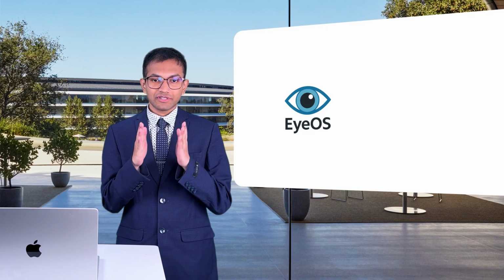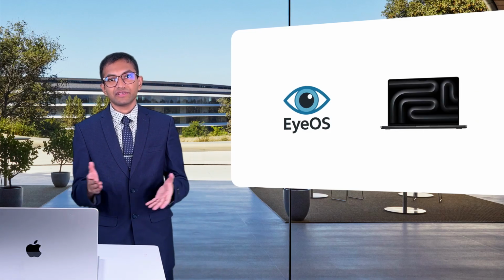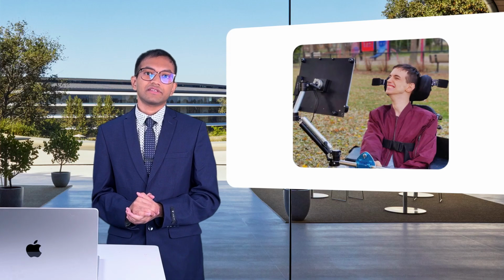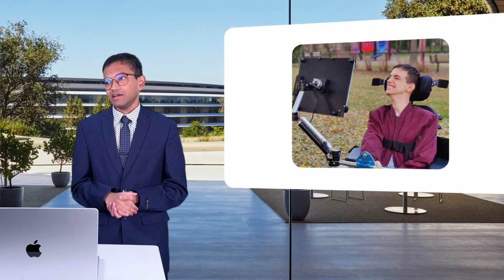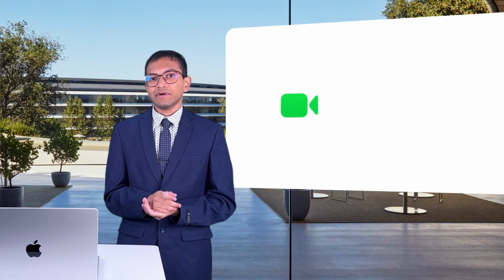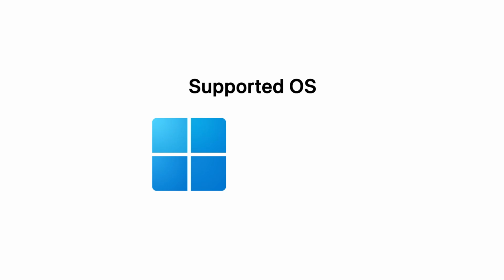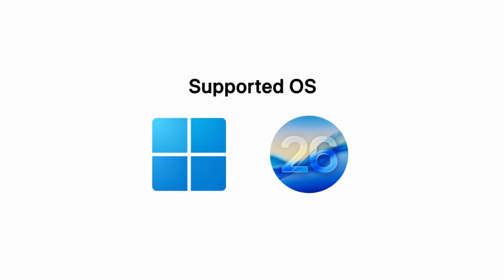Group 3, and today is the day we demonstrate our capstone project, EyeOS. EyeOS is a software solution that allows you to directly interface your computer without the need for any specialized hardware. It targets users with limited or no hand mobility. It employs the power of your webcam, microphone, and an optional foot pedal clicker. EyeOS is available in both Windows and macOS operating systems.